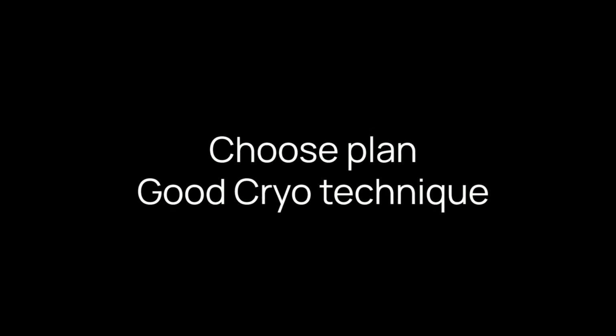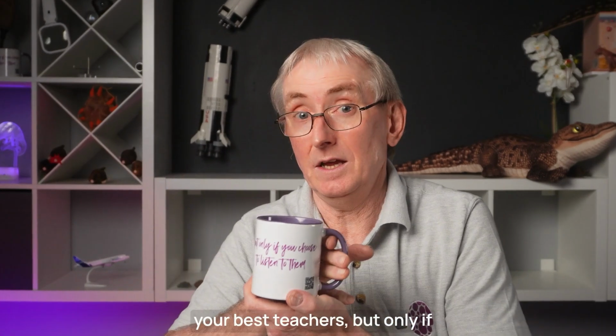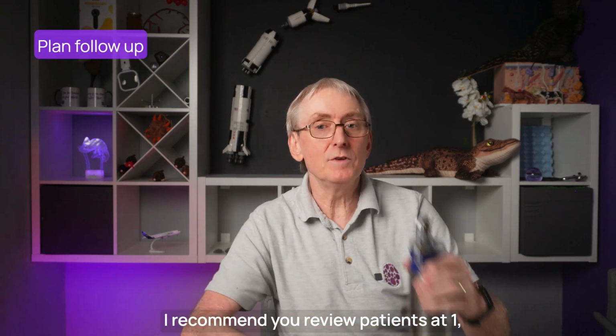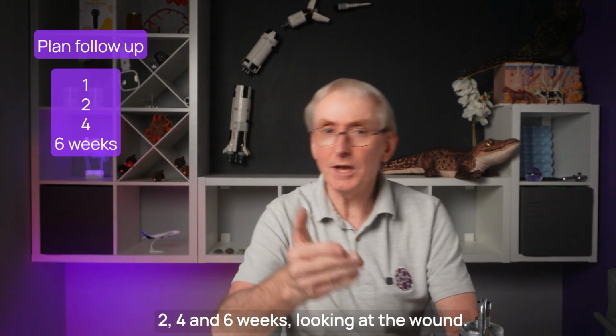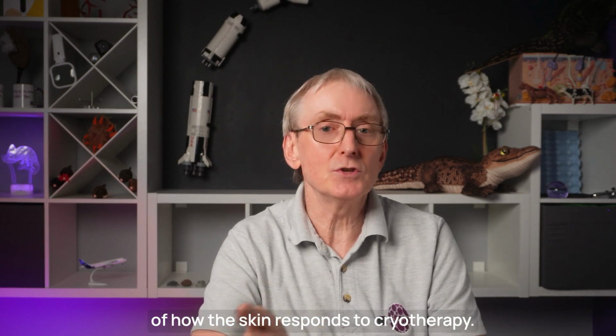Step 5. Choose the right plan and use good technique. Remember, your patients are your best teachers, but only if you choose to listen to them. When starting out using cryotherapy, I recommend you review patients at 1, 2, 4 and 6 weeks, looking at the wound. In that way, you will build up an understanding of how the skin responds to cryotherapy.